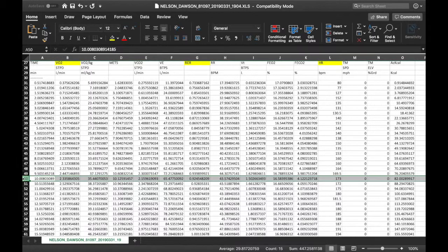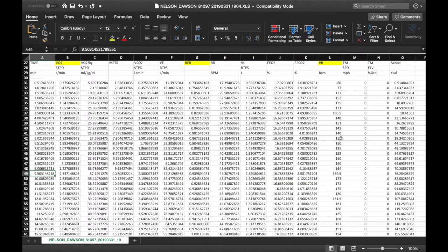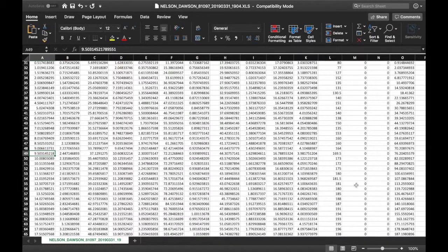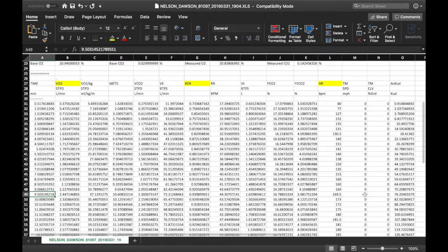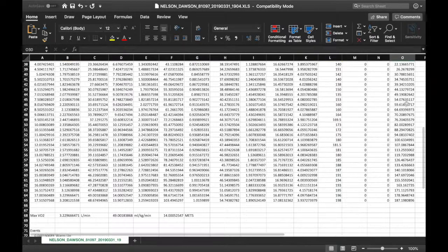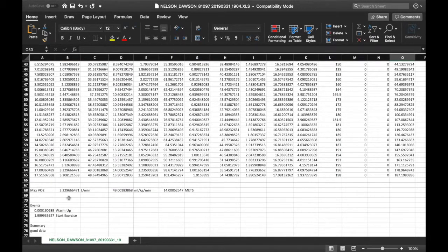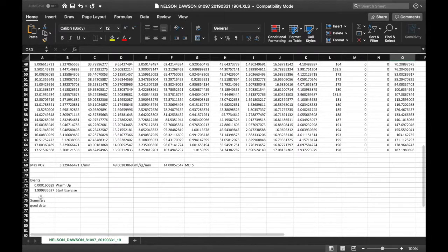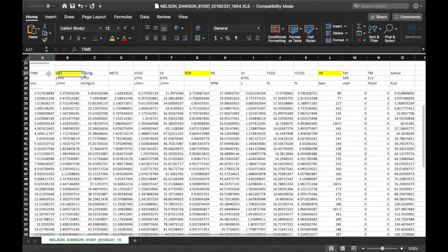Treadmill speed and treadmill elevation would come up if you ran the VO2 protocol through the metabolic cart, but we did a manual test just increasing the speed on the treadmill with the buttons, so that's why those didn't populate. Those columns can be useful for looking at different heart rates at different speeds and grades. Last but not least is calories, based on the metabolic cart.